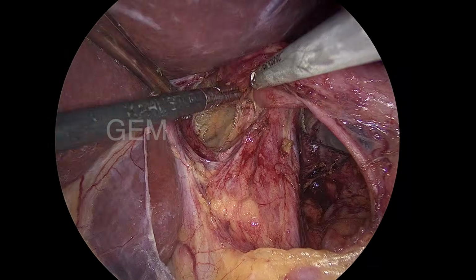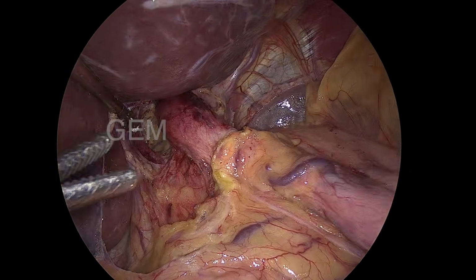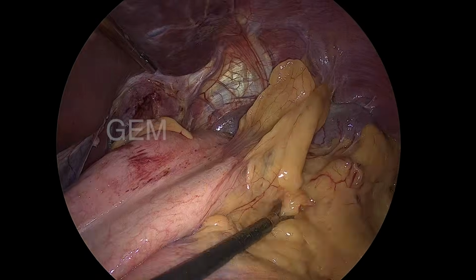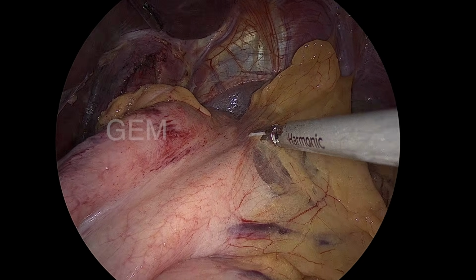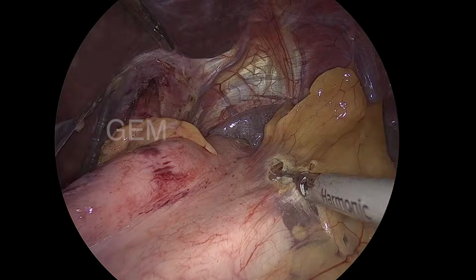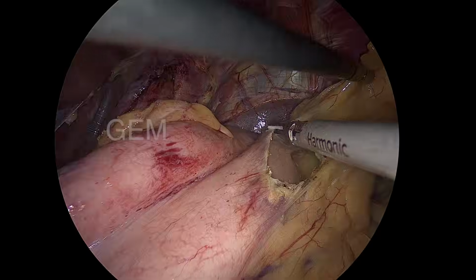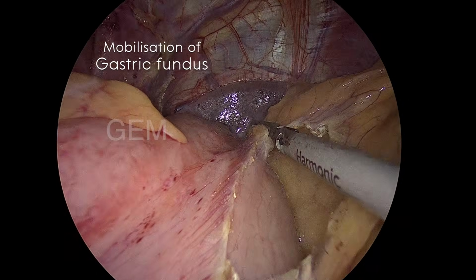So that is the advantage of this type of retractor compared with the Nathanson retractor. You cannot go to the mediastinum with the Nathanson retractor. So I am dividing the greater curvature side and fundus side. So I am mobilizing the fundus. I am entering the lesser sac. So only one or two vessels are to be divided.